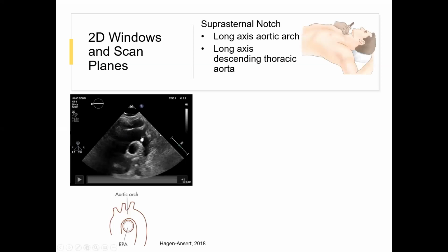So you have the aortic arch long axis view coming here. If they only all looked like that, beautiful. And oh, go back. So in terms of the measurements, we would have already done the ascending from the parasternal long axis. So you can do an arch measurement, you can do an isthmus measurement, and you could do a descending if you can see it.